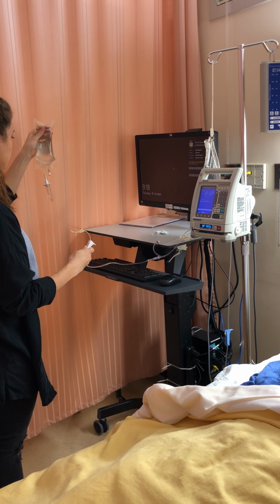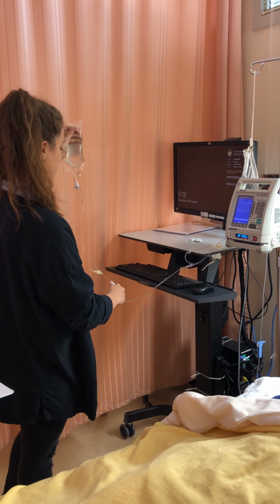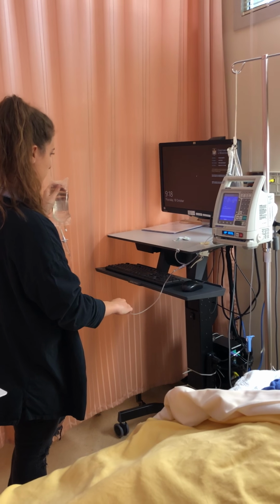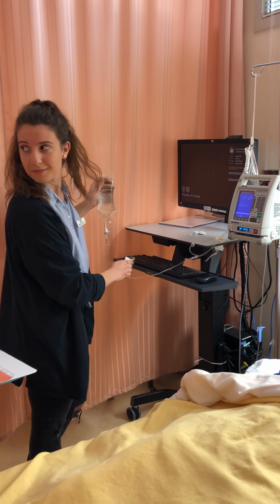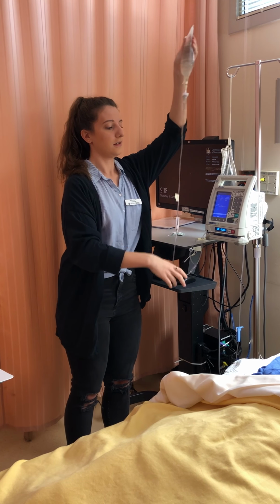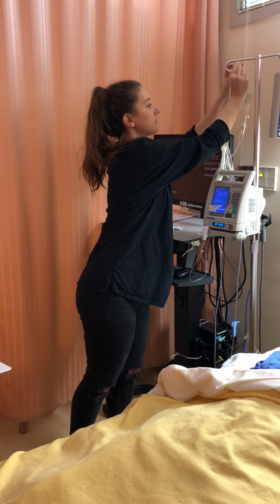Okay, so my chamber is half full. I guess I can try.